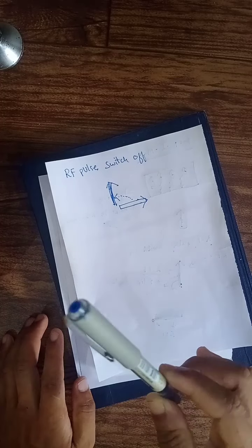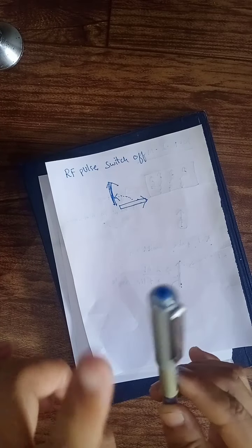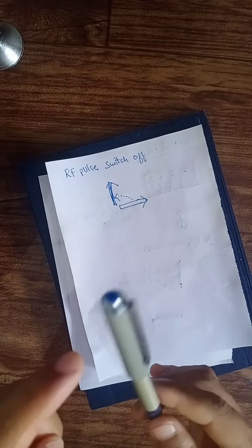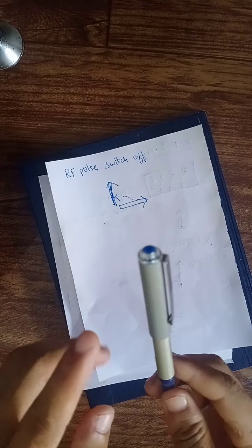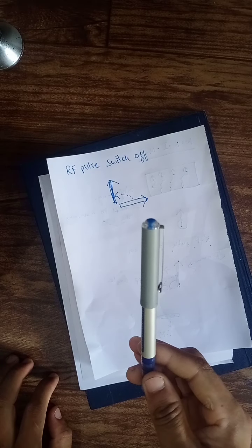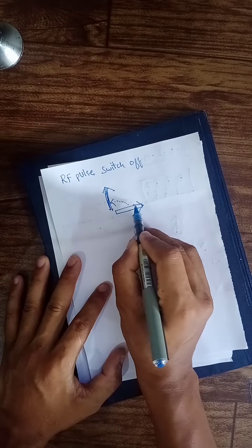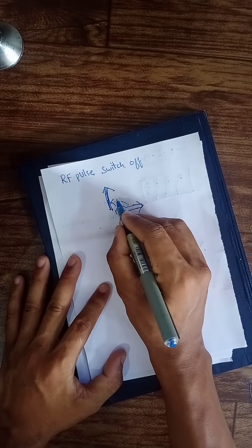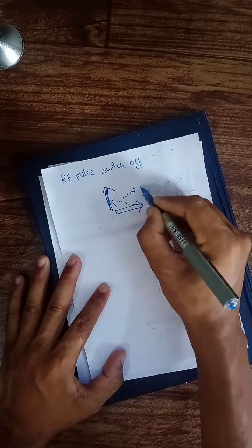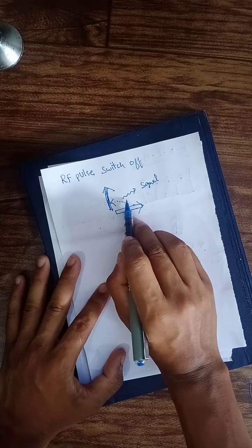The moment you give the RF pulse, what happened? The tuning should be there. That means the RF pulse and the tuning of the proton should match. If it doesn't match, you won't get the signal. See how the signal goes. When you switch off, the transverse magnetization will go towards the longitudinal magnetization. In between, it passes a signal.